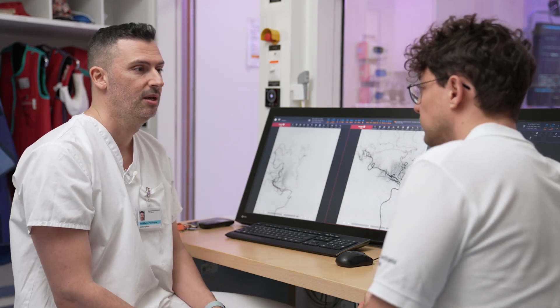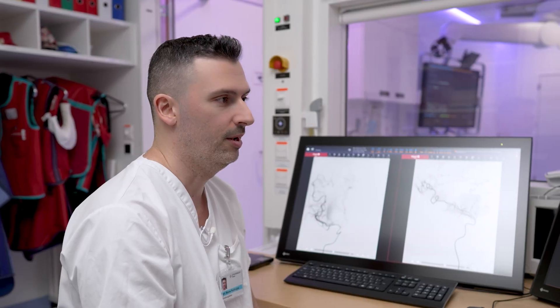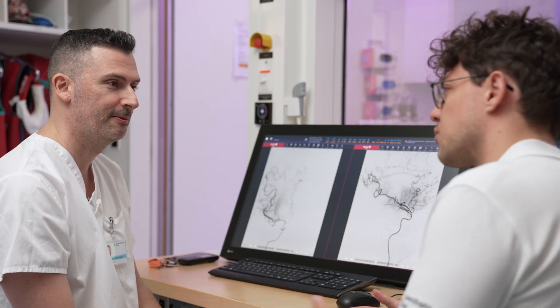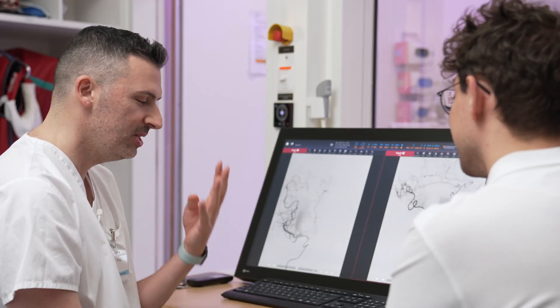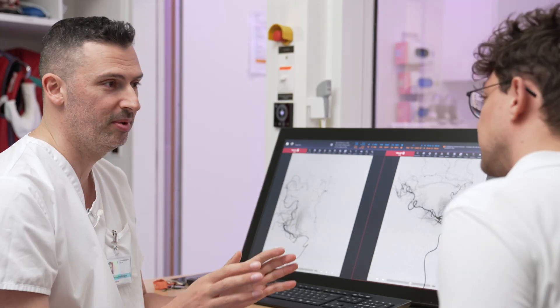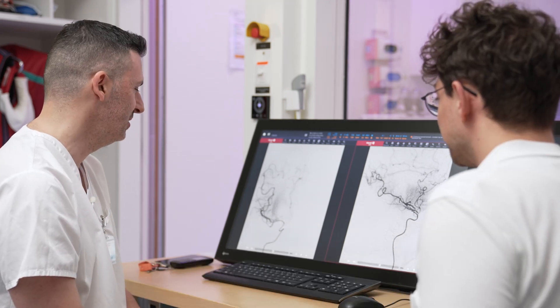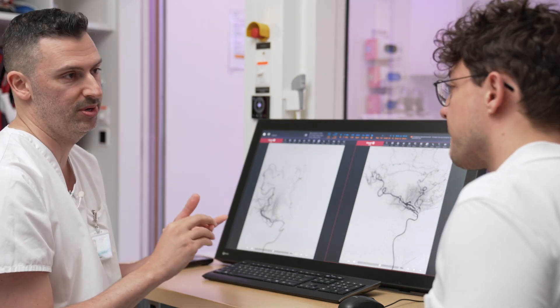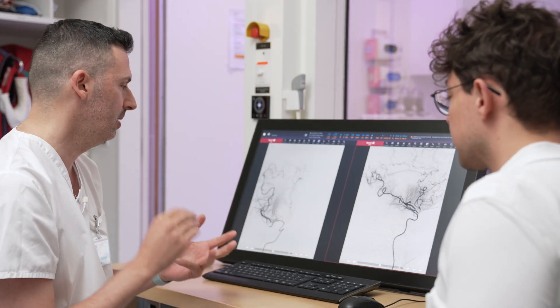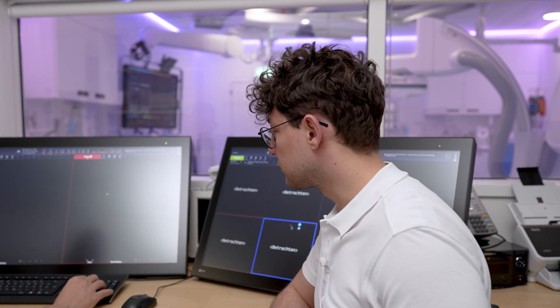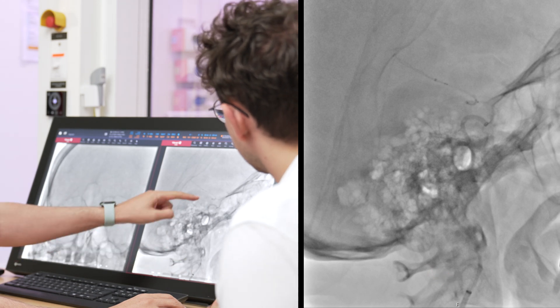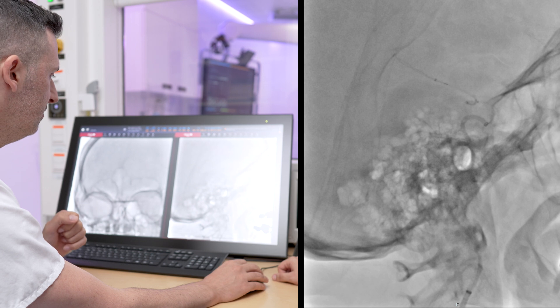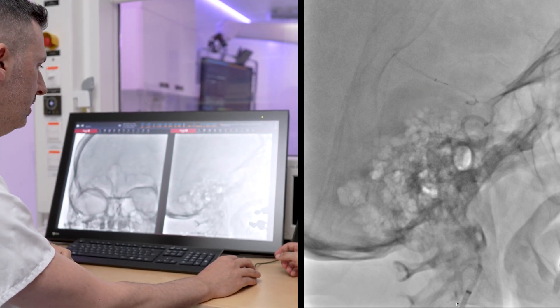Here we decided to go for a distal thrombectomy with a small stent retriever and our so-called quattro technique. If you haven't heard about the quattro technique, click on the description below for our full tutorial. So what's the quattro technique? We use four materials, four devices — that's why we call it the quattro, it has nothing to do with Audi. The idea is that you use your guide catheter, an intermediate aspiration catheter in the M1, then a small aspiration catheter — usually the 3-max — which you place in the M2, and also a stent retriever, usually a 3 mm stent retriever. So the guide catheter is down on the ICA, the large aspiration catheter is in the distal ICA and will go up to the M1 when we retrieve, and then you have your distal aspiration catheter and stent retriever in the M2.